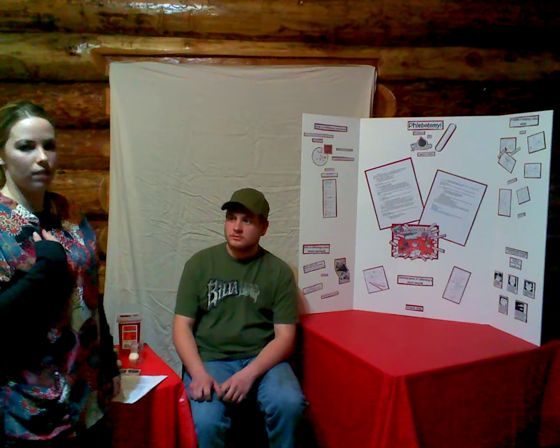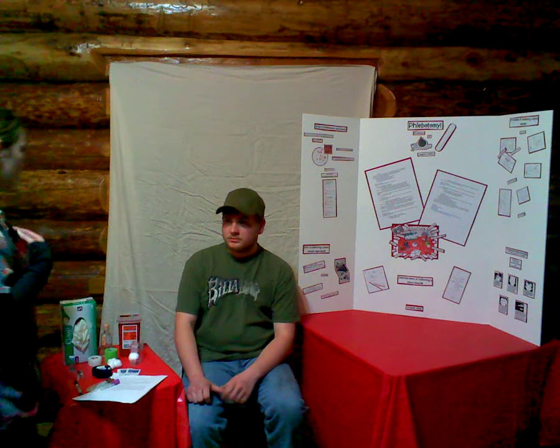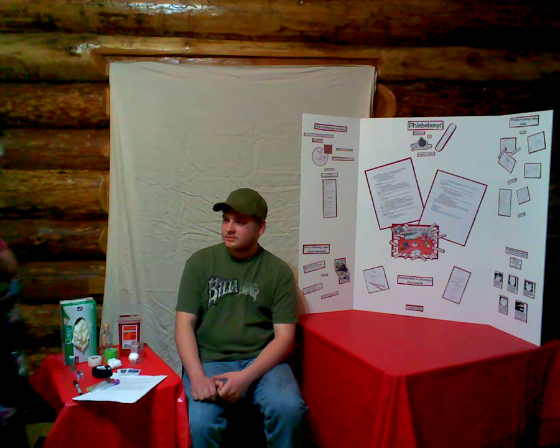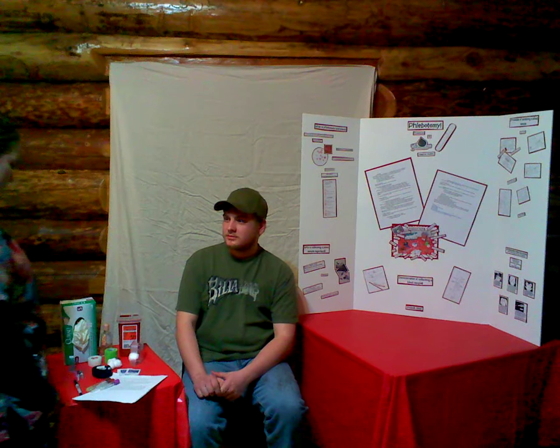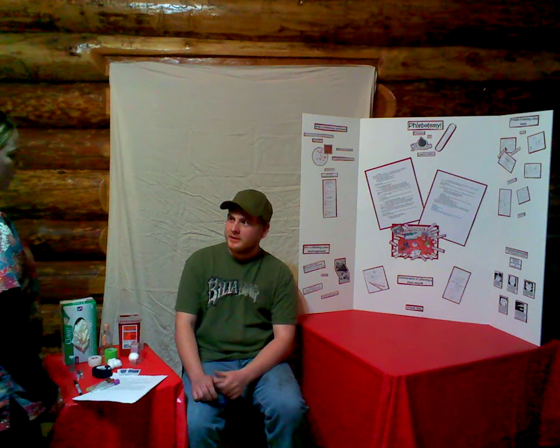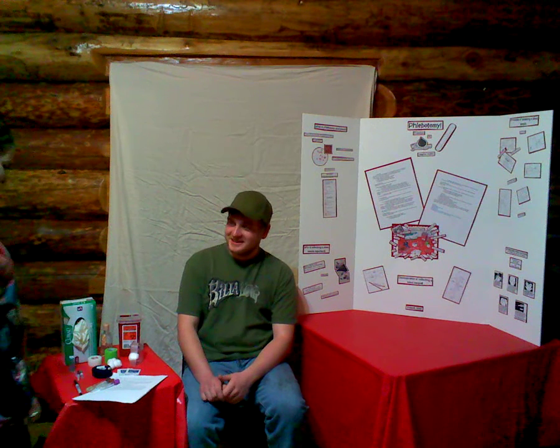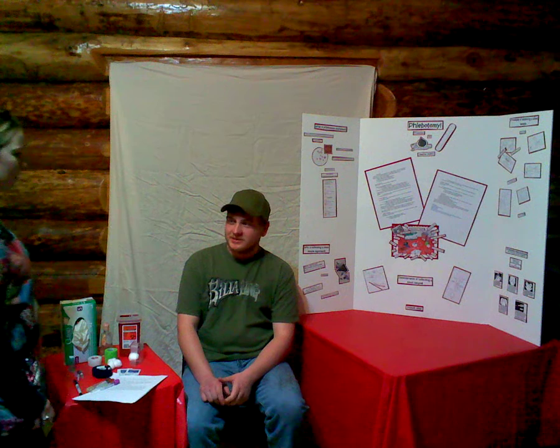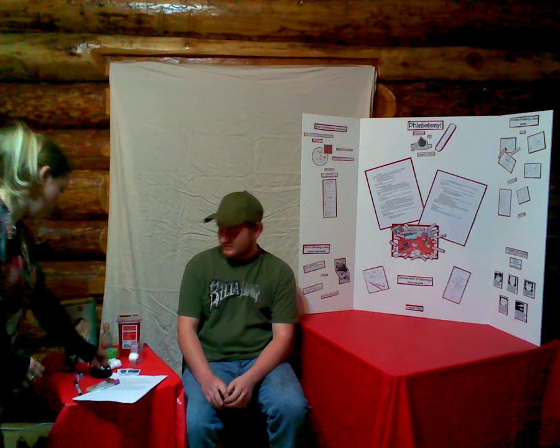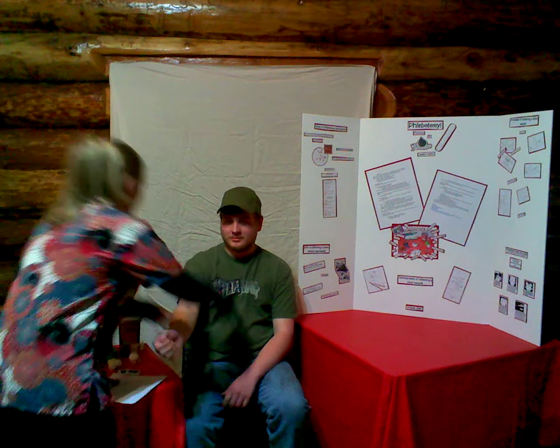Collecting a blood sample, with me as the phlebotomist and Vaughn as the patient. Hi, I'm Heather. With the lab, your healthcare provider ordered some lab tests on you today. I'm here to draw your blood. What's your name? Vaughn Patton. And your date of birth? March 7th, 1990. And what's your phone number? 476-7050. Okay, well, let me just look for a vein here, the best one to obtain a blood sample.